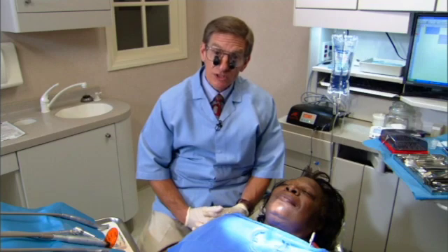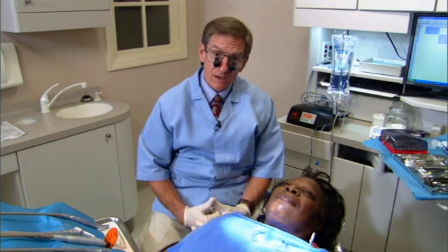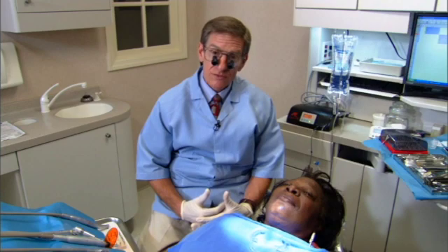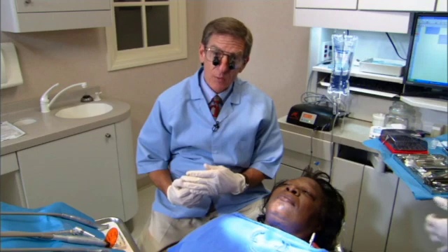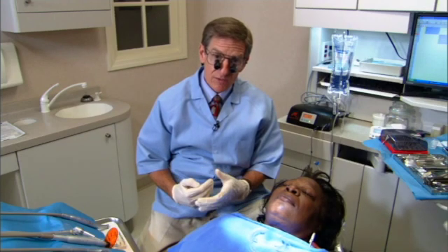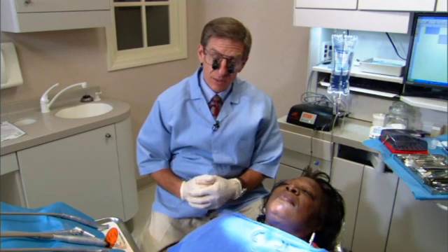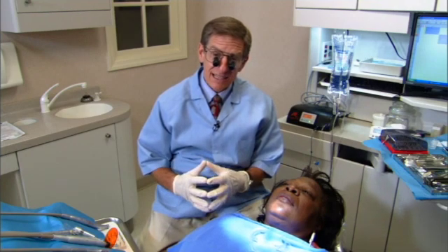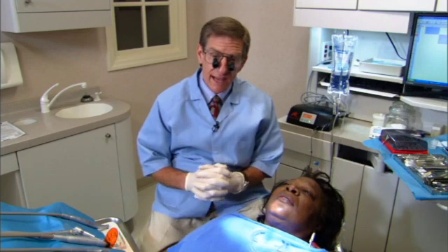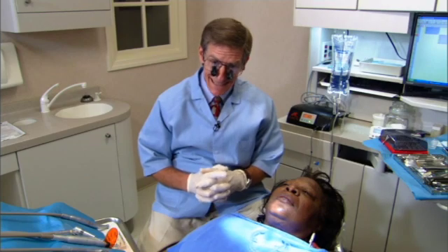We start our clinical procedure. We've gotten Beverly already numbed up really good. And our goal initially is going to be to prepare the teeth that will serve as abutments for our crown and bridge. So I'm going to start on the right side, and we'll prepare number 6 and number 8. We'll leave number 7, we'll leave number 10, and we'll leave 5 and 12 until I have the abutment teeth prepared, just to keep everything clean and the area free from any kind of blood or anything like that. So I'm going to start by preparing 6 and 8.